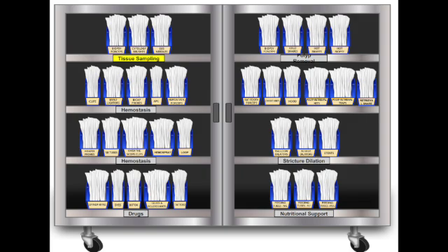Precisely. You grasp the sharp object with forceps through the scope, then retract it into the hood. The hood then inverts or covers the object as you withdraw the entire scope, shielding the esophagus and throat from injury. Clever design. Any other retrieval methods?